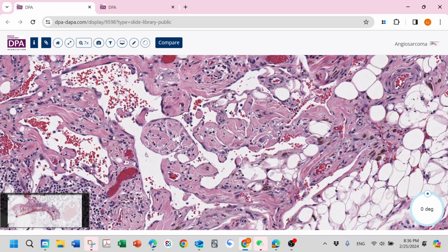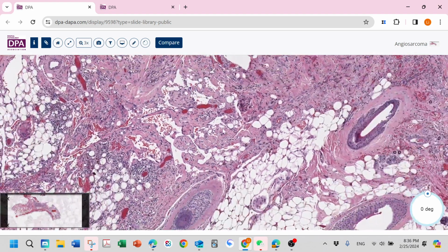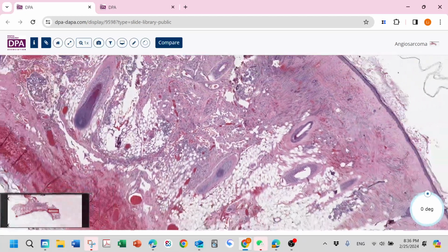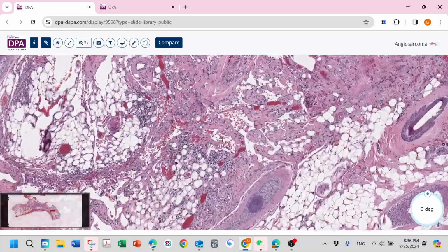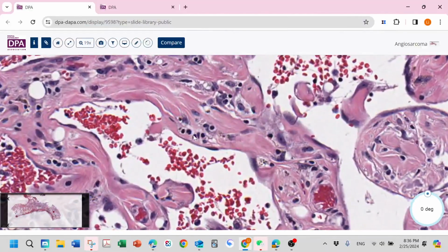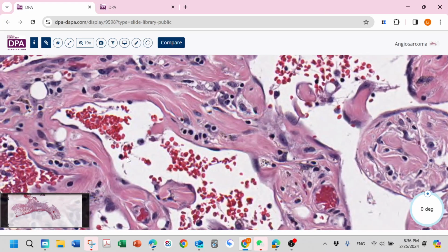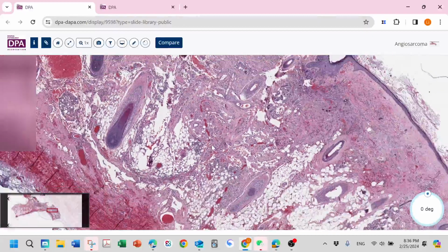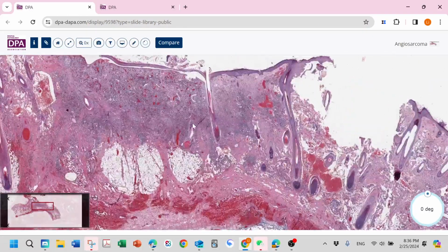I think you still remember when I talked about papillary endothelial hyperplasia, but in that lesion you find all these structures just inside a big lumen of a thrombosed vessel. This one, they just infiltrate everywhere, and the cells are really dark, hyperchromatic, atypical, polymorphic. Then you know this should be an angiosarcoma.